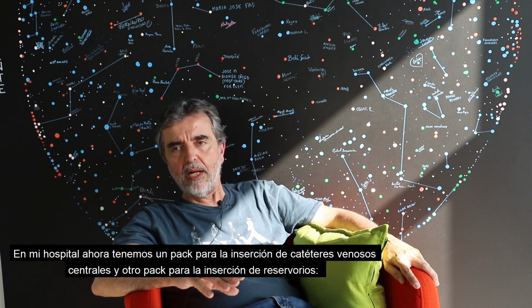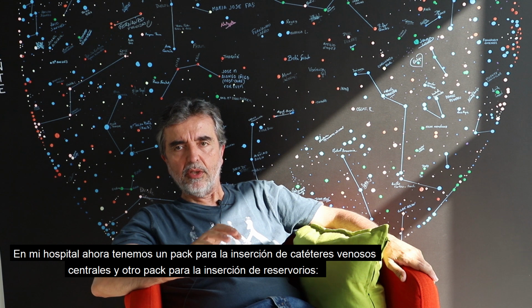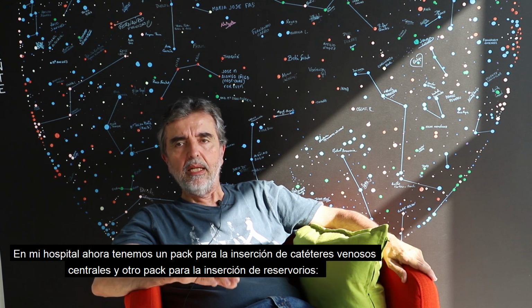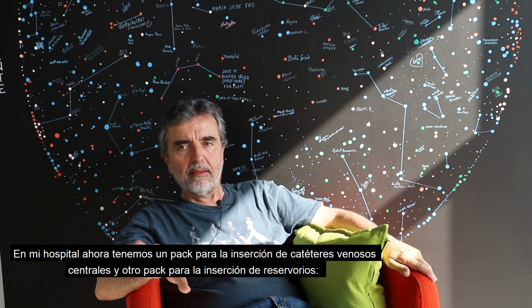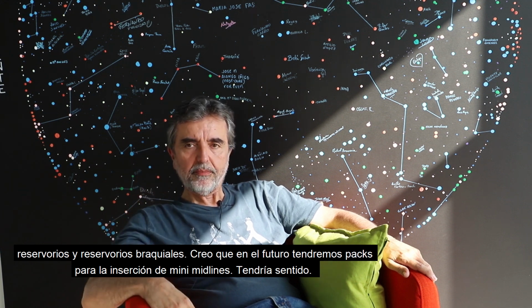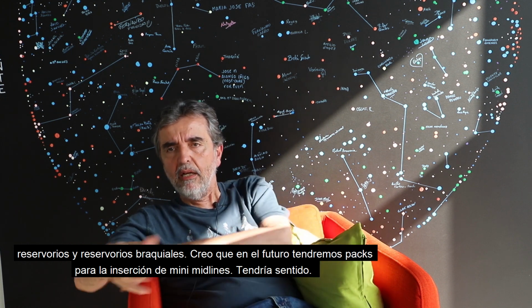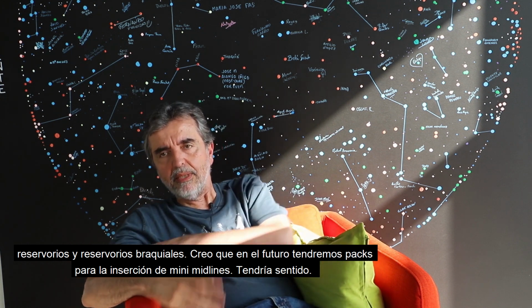In my hospital, we have now a pack for the insertion of central venous catheters, and another pack for the insertion of ports, PICC ports and chest ports. And I think we can manage. In the future, I think we will also have packs for the insertion of mini-midlines, which makes sense.